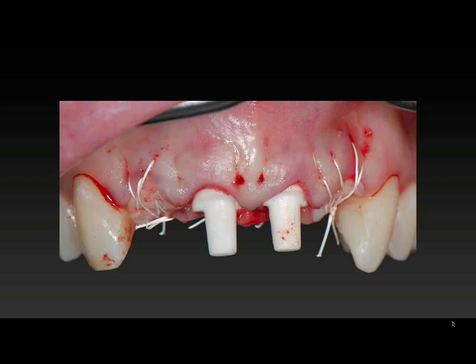In this case it would be very, very difficult to get an ideal result, whereas with these materials our options are much greater. So this is at the time of surgery — implants are placed. We have a little bit of socket grafting on the two laterals.